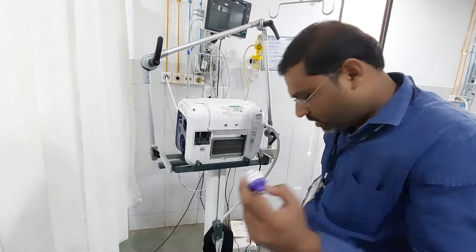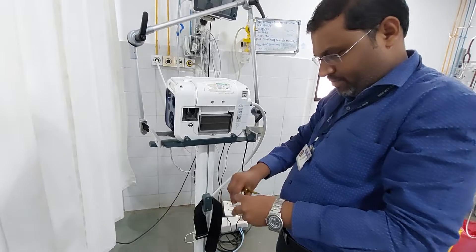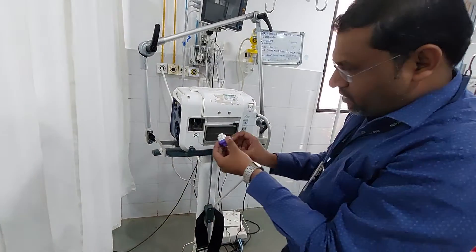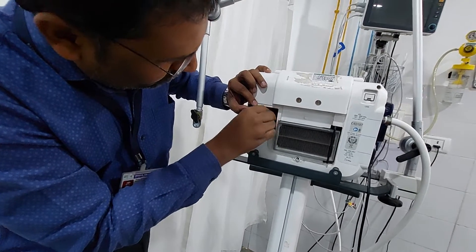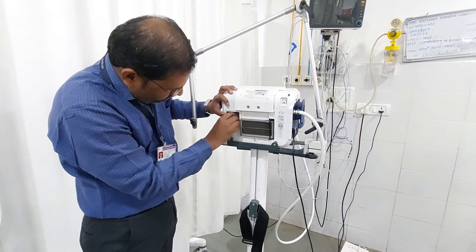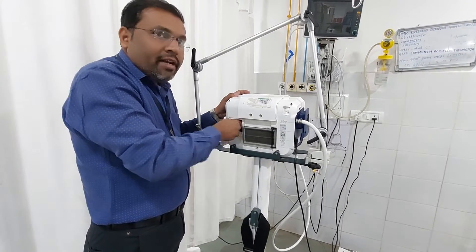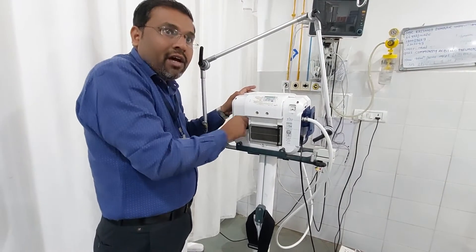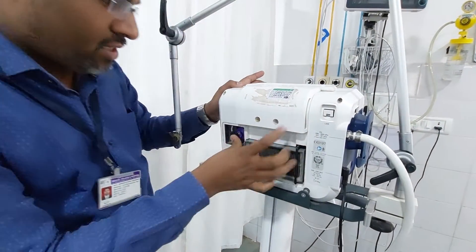Once it gets removed, take the new one. This is your new one. To fix it again, just keep it like this — put it inside the slot and rotate properly. Tighten it properly.